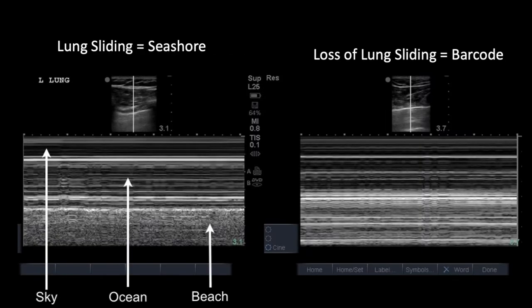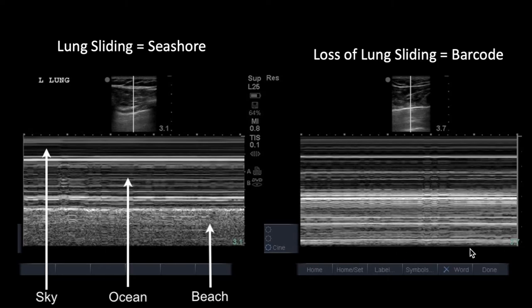If you place M-mode across the pleural line, here's what normal lung sliding looks like — a nice granular beach pattern. But when you lose that pleural sliding due to pneumothorax, there's no longer a granular beach pattern. Some people call this the barcode sign, where you have linear lines instead of a beach or granular pattern. This loss of lung sliding is very concerning for pneumothorax.